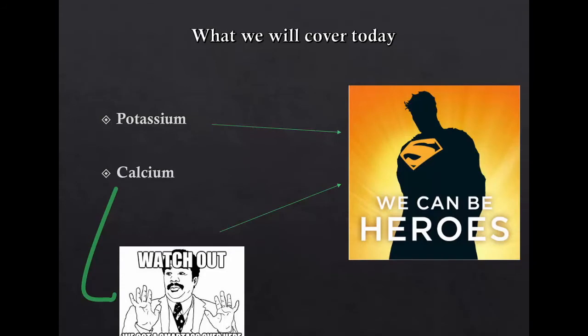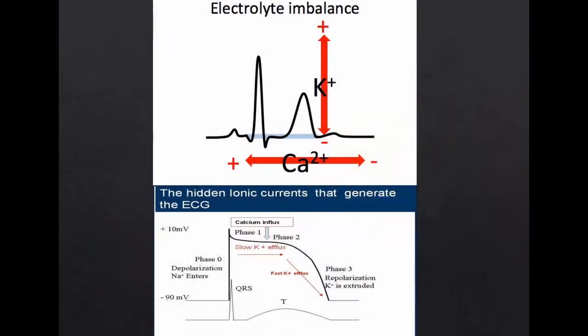All right, we're just going to focus on two big disorders, disorders of potassium and disorders of calcium. That's it. Now, the amount of basic science is inversely proportional to the interest in the lecture. So we're not going to spend an enormous amount of time on this. And all that I want you to remember is that potassium-related disorders are vertical with slight horizontality, and calcium disorders are horizontal. That's it. If you sleep now, it's okay.